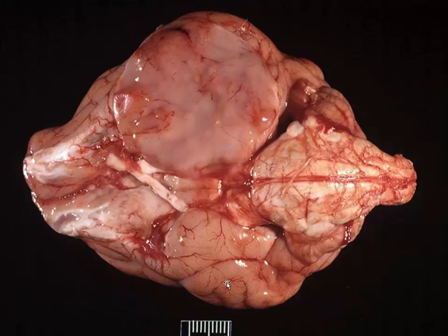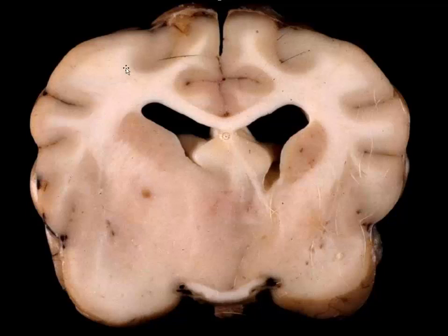They also go through what affects the different markers, including time from death to autopsy. All these sort of affect these immunomarkers that we count on so highly to diagnose these particular tumors. And here's a cross-section of this particular one, and you can see that unlike that oligo, this particular tumor doesn't really have good borders. It's growing quickly, so you don't get that. And when you add that to the amount of edema here, it's very difficult, and you can tell how the neurosurgeons might go in there and they really can't tell where the borders of this neoplasm are, which makes their job even more difficult.